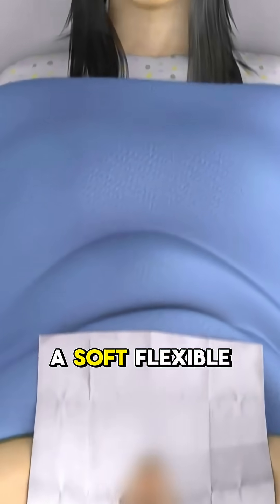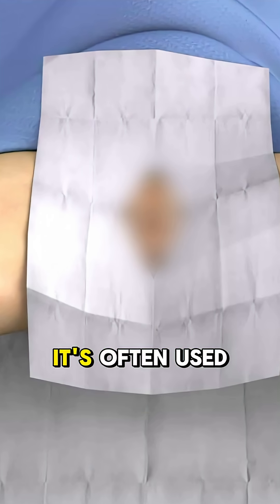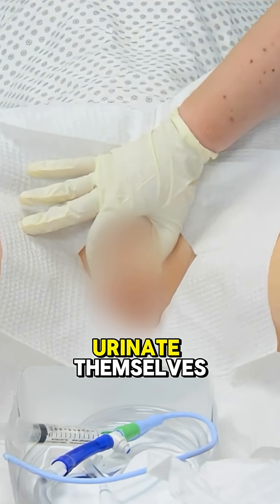This is a urinary catheter: a soft, flexible tube that drains urine straight from the bladder. It's often used for women after pelvic surgery, spinal injuries, or in critical care when patients can't urinate themselves.